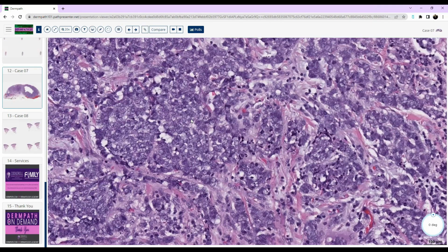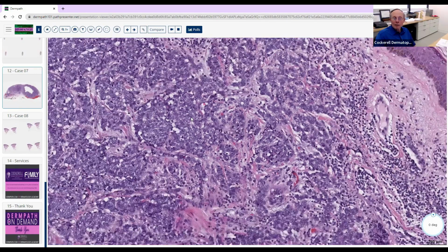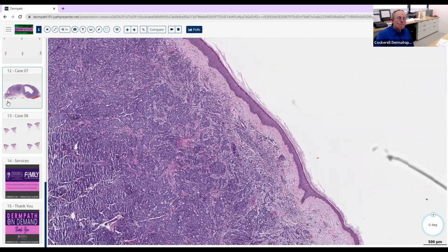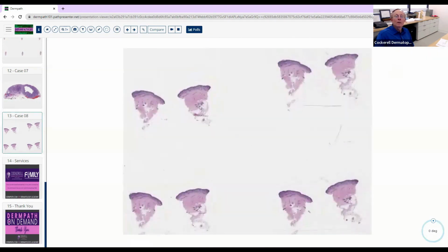Oh, polyomavirus? Good. Polyomavirus. So sometimes that's like a maybe basic science kind of question. So they might ask you a second order question, expecting you to know that human polyomavirus has been associated with this tumor. Okay, good. So one last one.